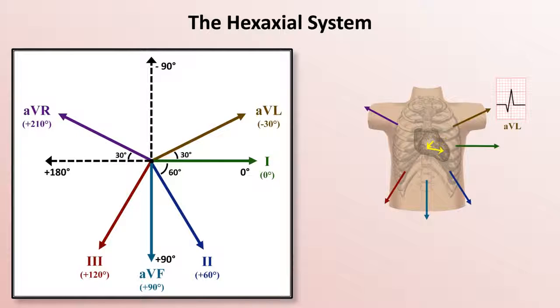I'll now walk my way around the EKG leads. Because the first depolarization vector is not in as complete an opposite direction from lead 1 as it was relative to AVL, the initial negative deflection in lead 1 is not quite as deep as in AVL. However, the second depolarization vector is in nearly the same direction as lead 1, so the later positive deflection recorded by this lead is taller than it was in AVL.